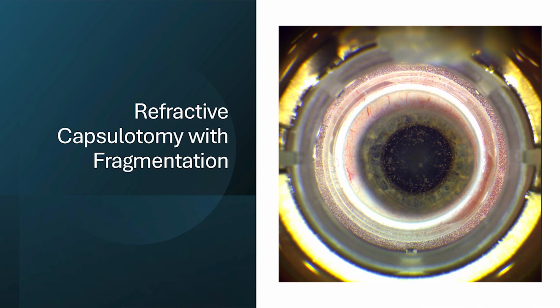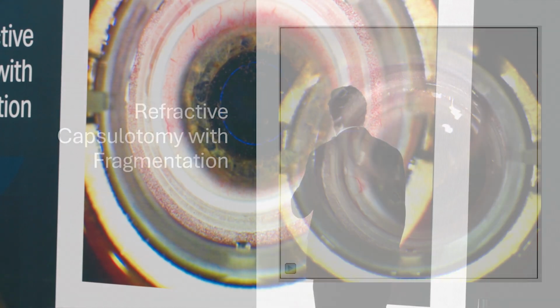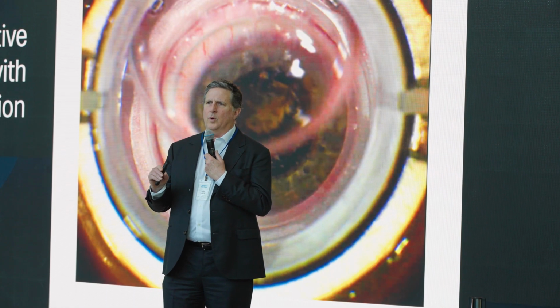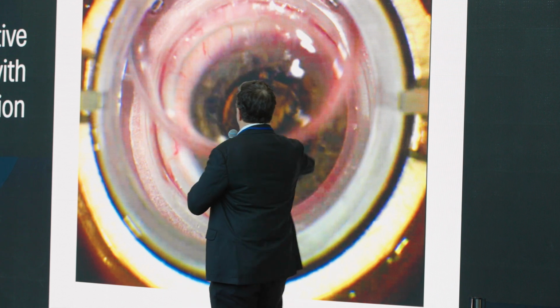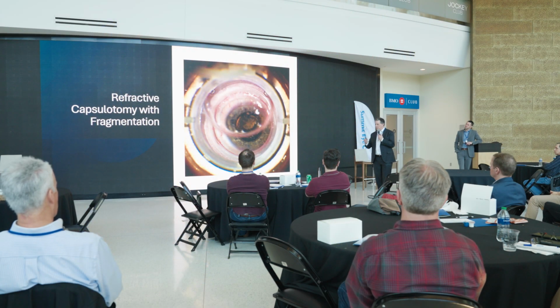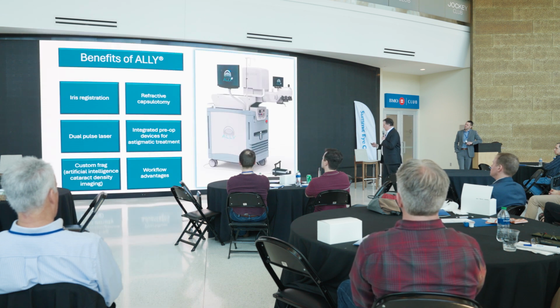So this is an image of the femtosecond laser that has just created the capsulotomy. It's very quick, and you can see that it is under applanation. It creates the capsulotomy. Now, did you see these little blue things right there? That is one of the biggest advantages that we have. That is iris registration. It's in fact capsular registration. So we now have the ability to use a toric implant in a way that is far more accurate than we ever could. Rather than marking the sclera, and then there's parallax, and you can be off by a little bit pretty easily. Now if you've got it at the level of the implant, you're going to get a very accurate placement.